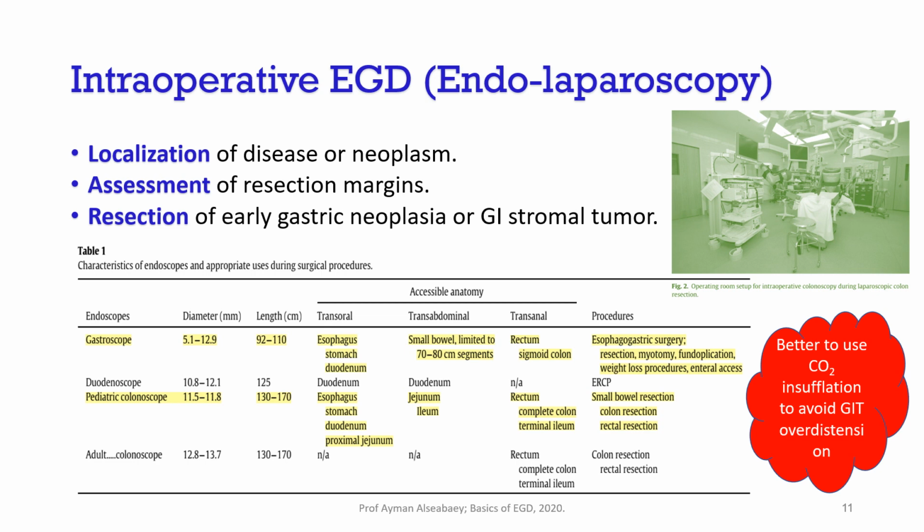There is a new concept now present in the literature. It is called intraoperative EGD or endolaparoscopy. Simply, the surgeon can call you to do intraoperative EGD. This is very common nowadays, and there are various indications for this.